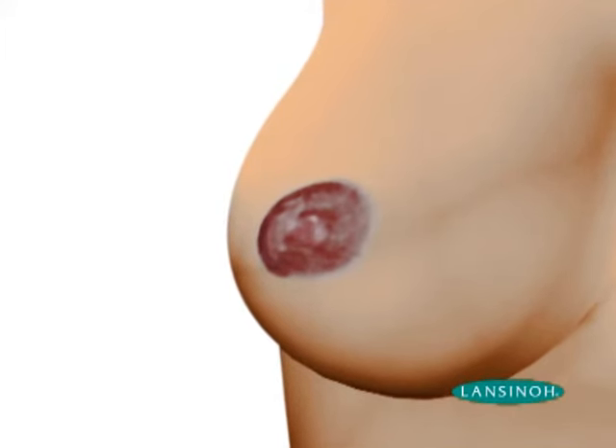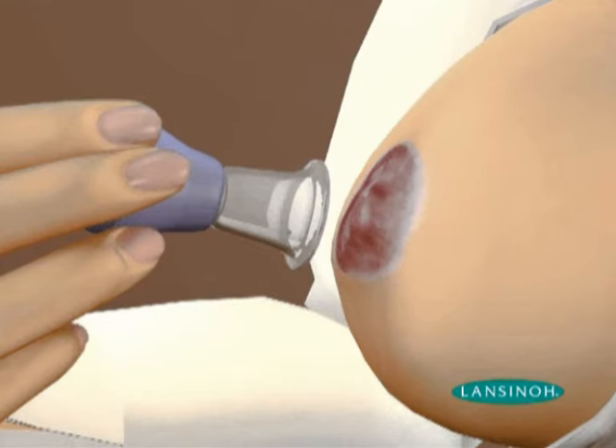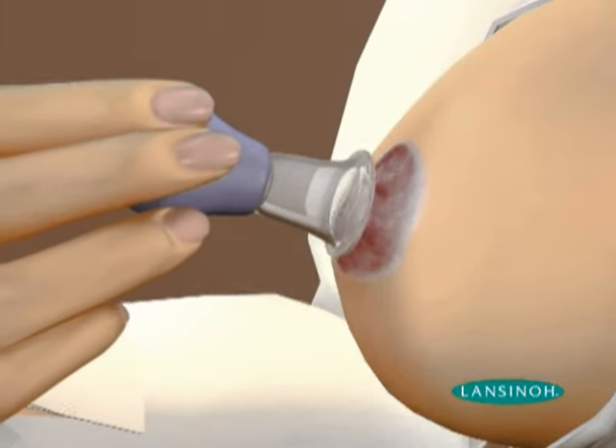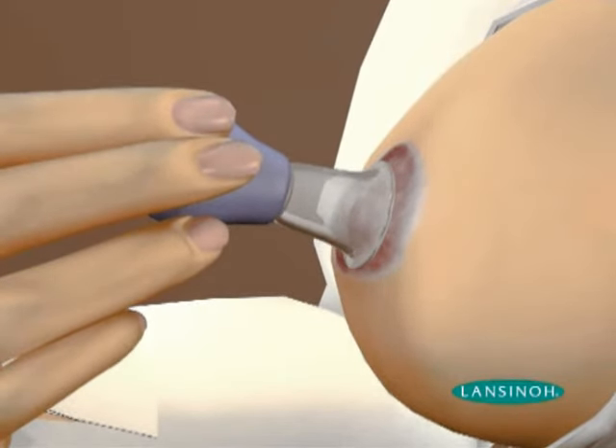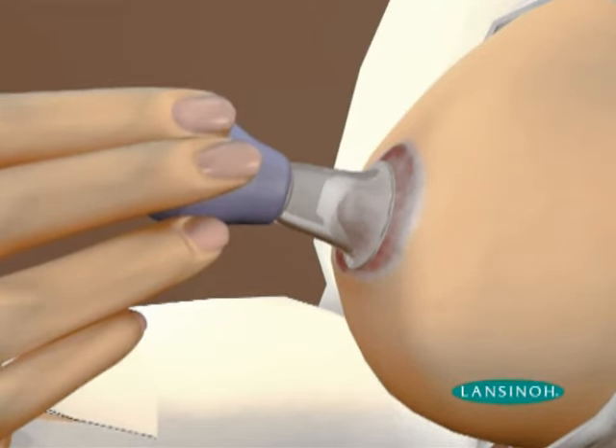In these circumstances, it is important for a mother to be able to gently draw out her nipple so that her baby can latch on comfortably to breastfeed. The Lansinoh Latch Assist is a discreet and simple tool designed to help temporarily draw out a flattened nipple so your baby can properly grasp the breast and areola.